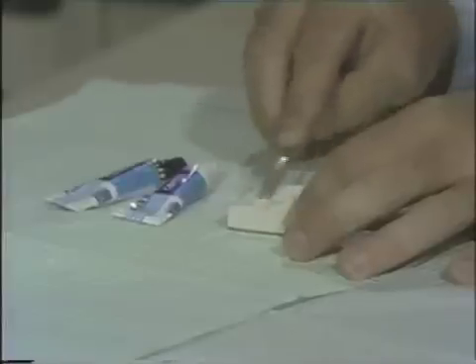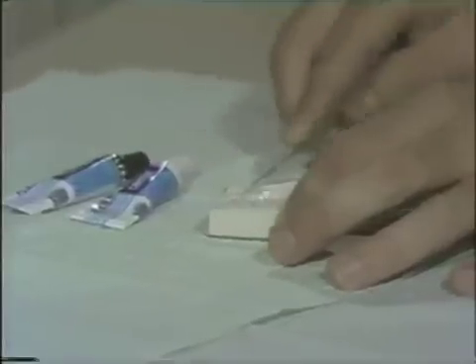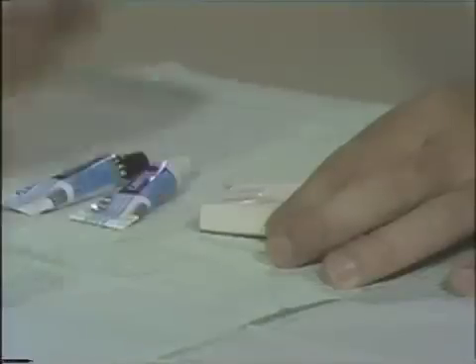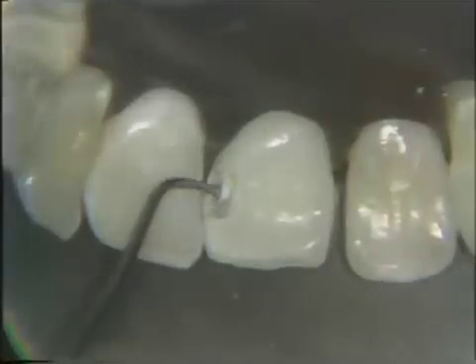And small amounts are used. Please note this. We are going to form our pulp protection cement bases in line or take the exact shape of the axial wall as it is. We use here the convex surface of a small spoon, a 17, or you can use a small ball burnisher.